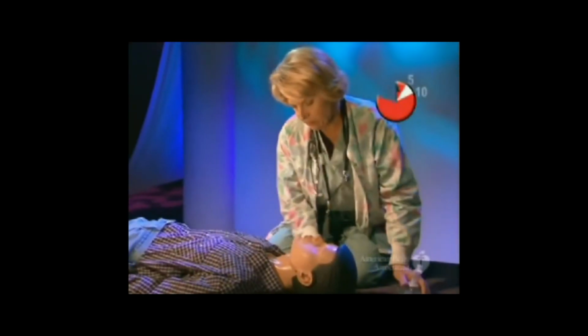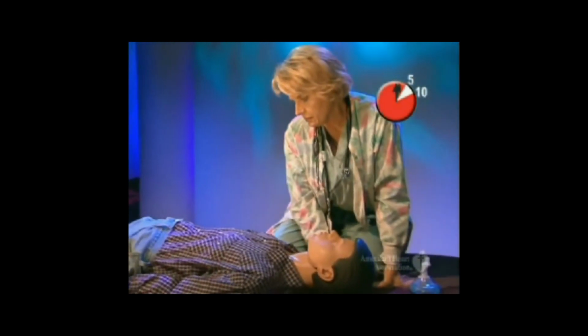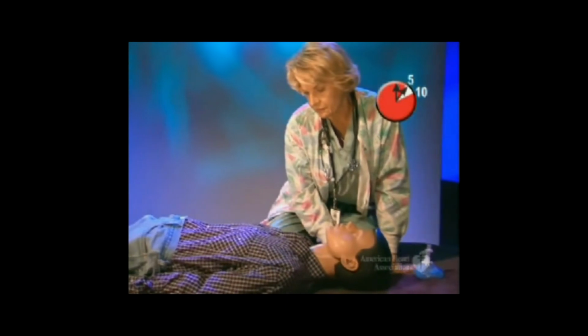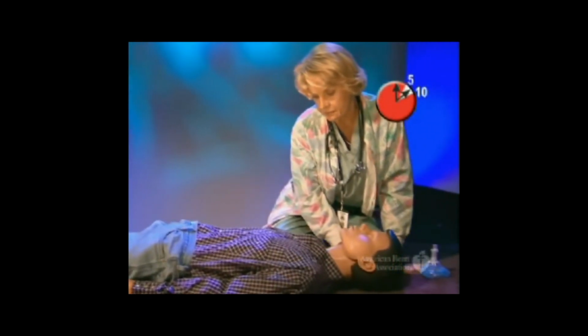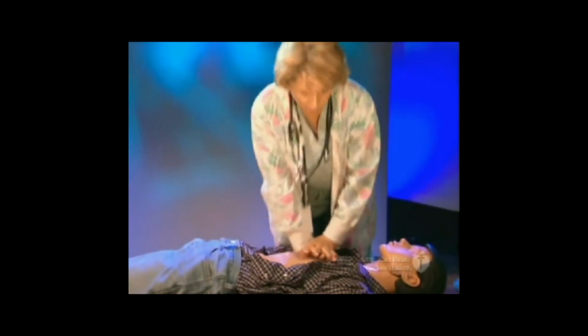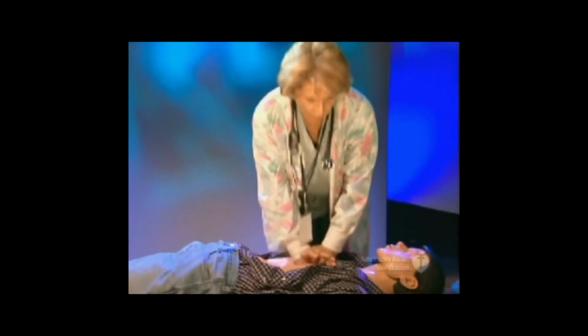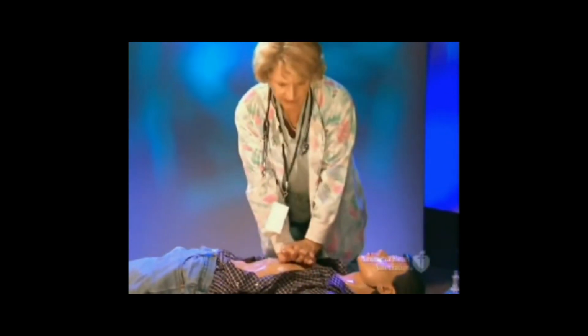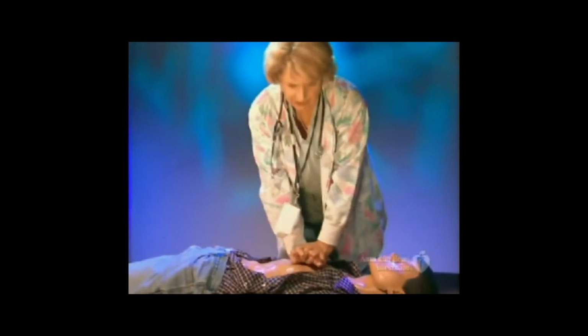And if you do not definitely feel one within 5 to 10 seconds, quickly move or remove the clothes from the front of the chest that will get in the way of providing chest compressions and apply the AED pads. Provide cycles of 30 chest compressions and 2 breaths, and use the AED when it is available.